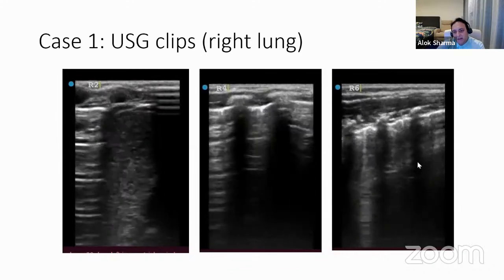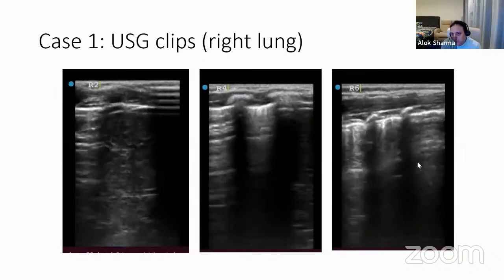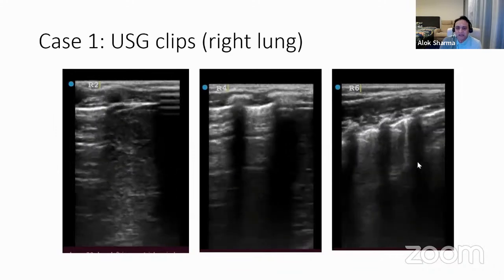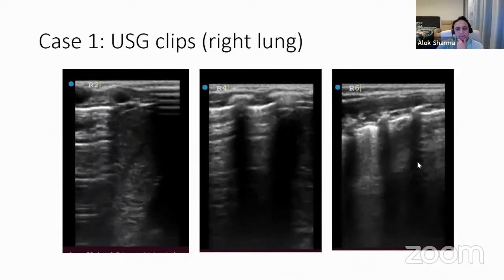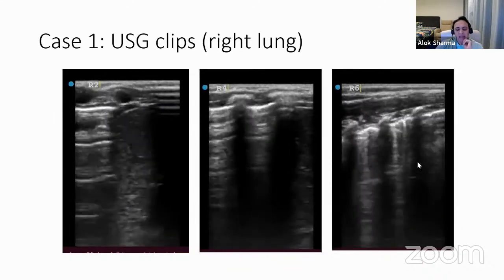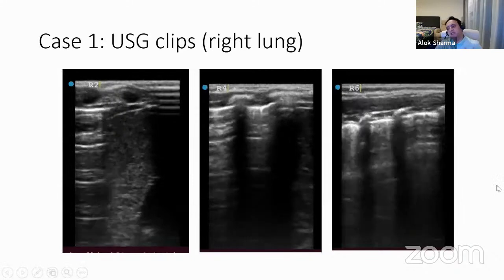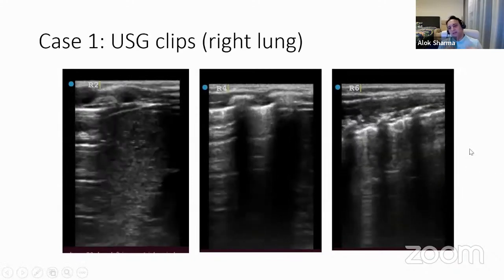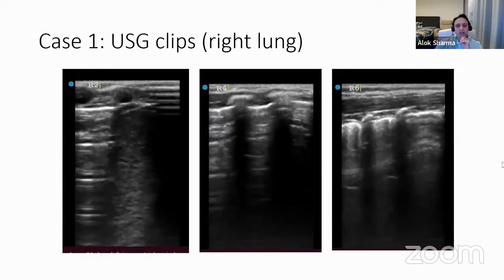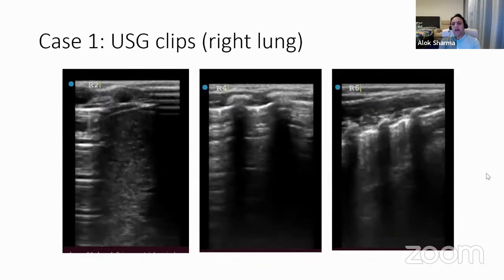Now, to be at 90 degrees, if the baby, say, is prone and you're examining the back at that particular point of time, then what sometimes happens is that the probe basically becomes oblique, or the upper half of the probe loses contact, as you can see at the top end of the margin. A good way of preventing that from happening is putting a small towel under the baby's chest, rather than having a sloping back, because the back tends to slope. I mean, I tend to hunch a lot. So really, you might want to put a towel under the baby's chest to keep the back as straight as possible and maintain your contact.